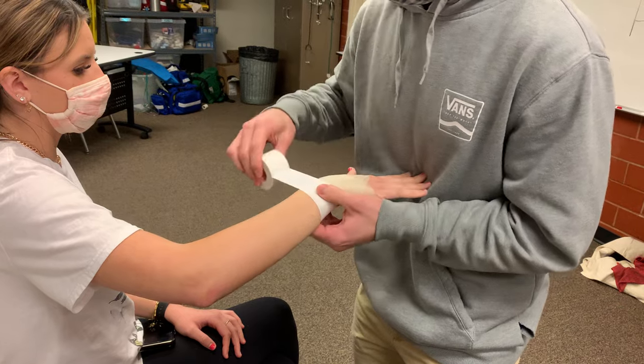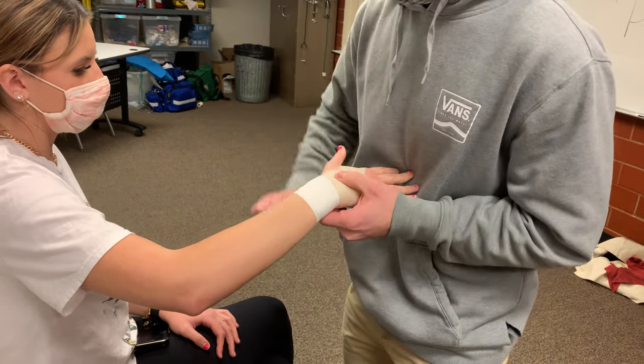We're going to apply a couple of anchor strips of tape at the base of the wrist. You can do it continuous or you can break the strips.